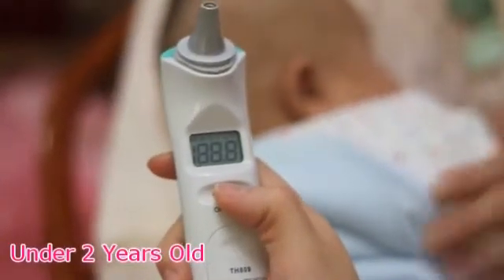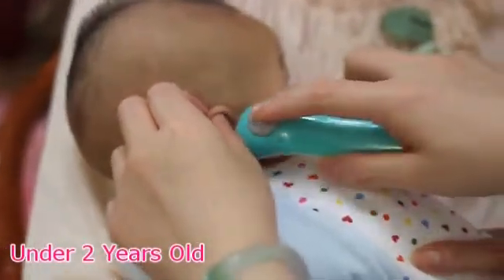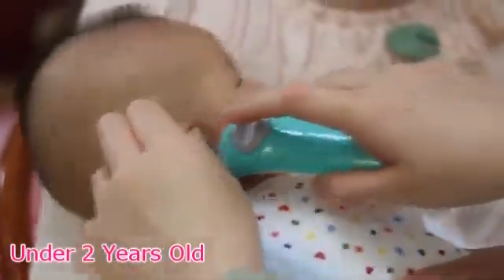For children under two years old, gently pull the ear straight back to straighten the ear canal. Then put the probe into the ear canal. Press the scan button to get temperature.